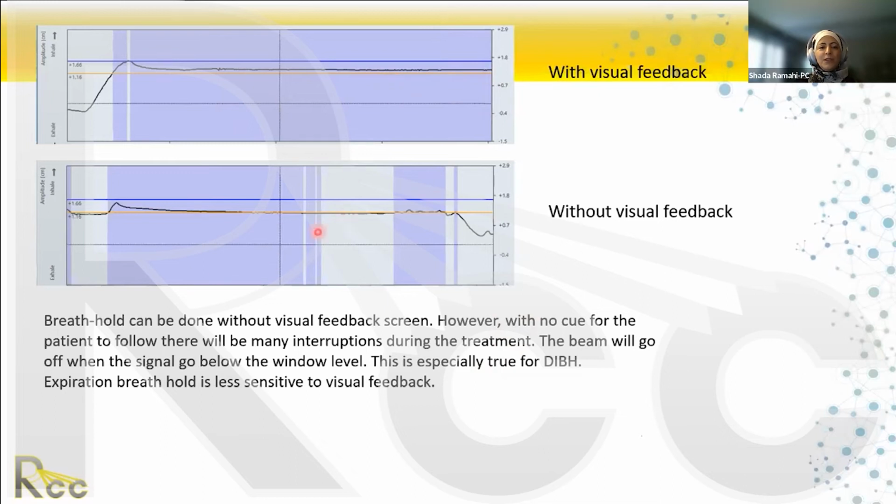Unfortunately, we had a regular phone that we connect to the network and that can display the screen. On that particular day, one of the CT SIM therapists did not show up for work, so we did not have the feedback for the patient. We thought we could do it, but you could see how it's really different. And we ended up canceling the appointment for the patient until the therapist was back.